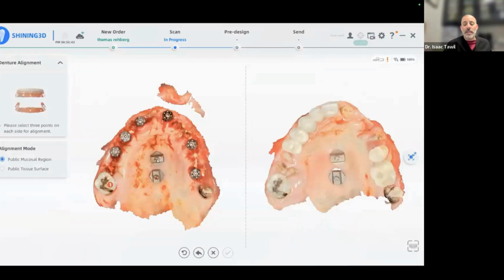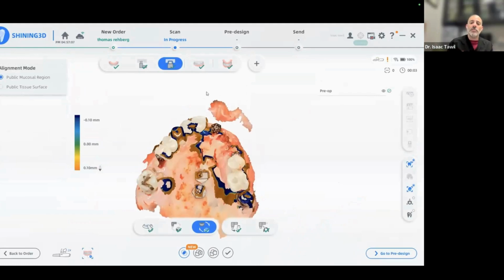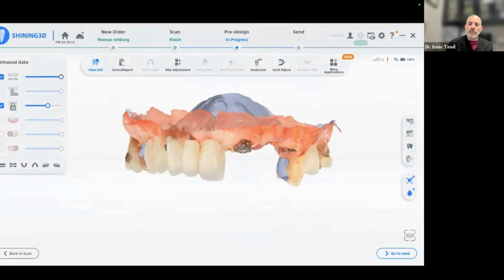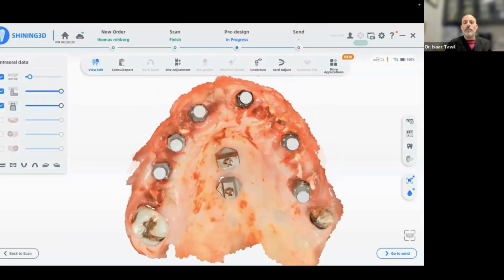Now, when it doesn't automatically align, it's okay. I can hit the automatic alignment button, or I can do point matching. I can pick object number 1, which is that molar, number 2, 1, 2, 3, and have it automatically align as well. So if it doesn't match the software, we can align. Then you'll notice that there are these dominoes there that look a little different than the other elongated dominoes that we have there. So let's go through that part.